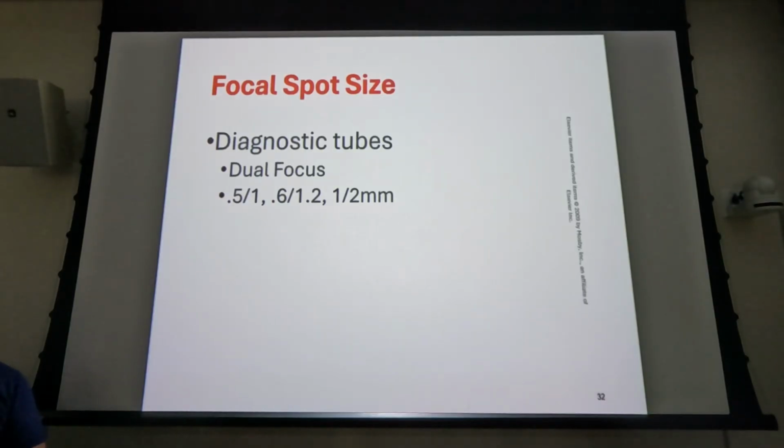So, if you run into a question on a test that asks what the difference should be between exposure on a large and small focal spot, your answer is, shouldn't be any, right? But you may have an answer on there that says you can't get exposure over 200 mA.